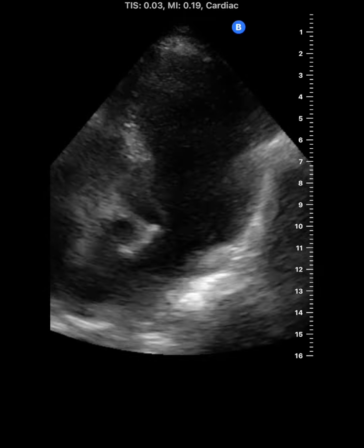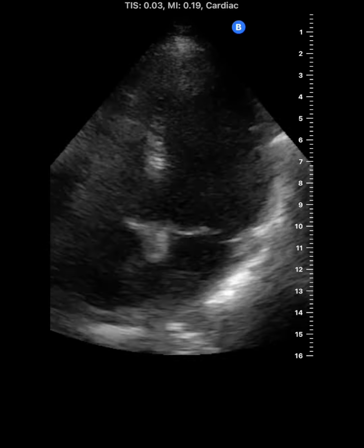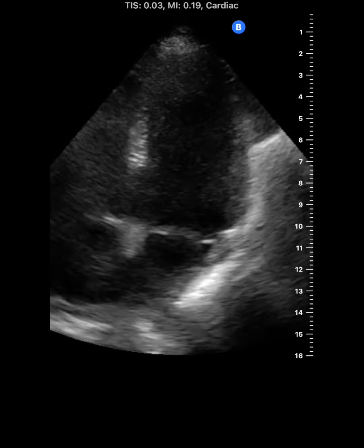Here's the exact same patient with the IQ3. It looks like there's less noise, less backscatter, and a clearer image overall.